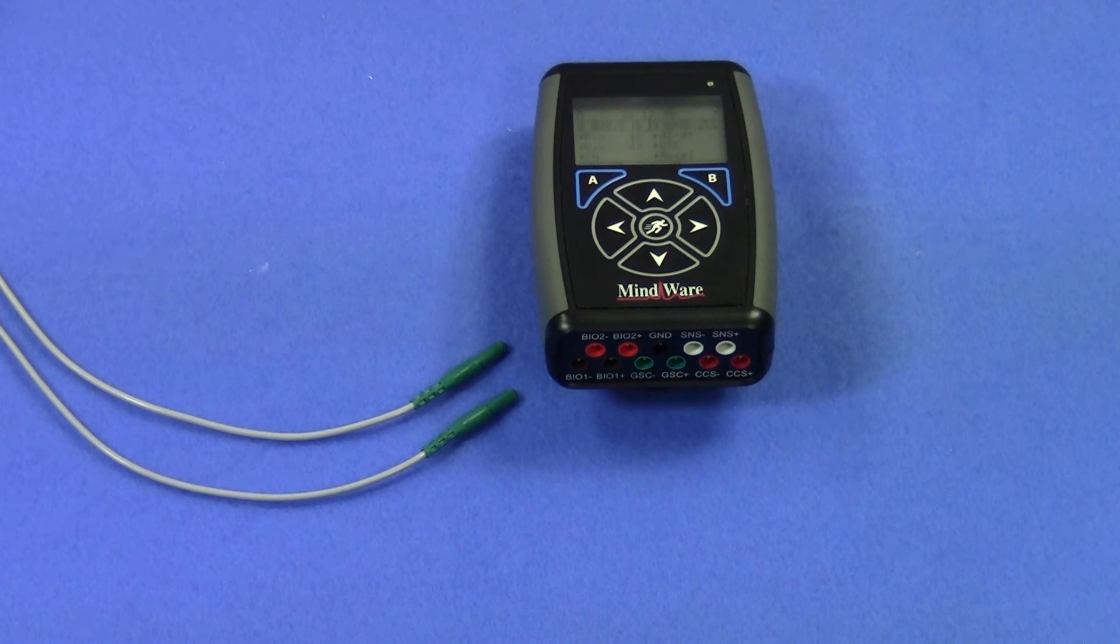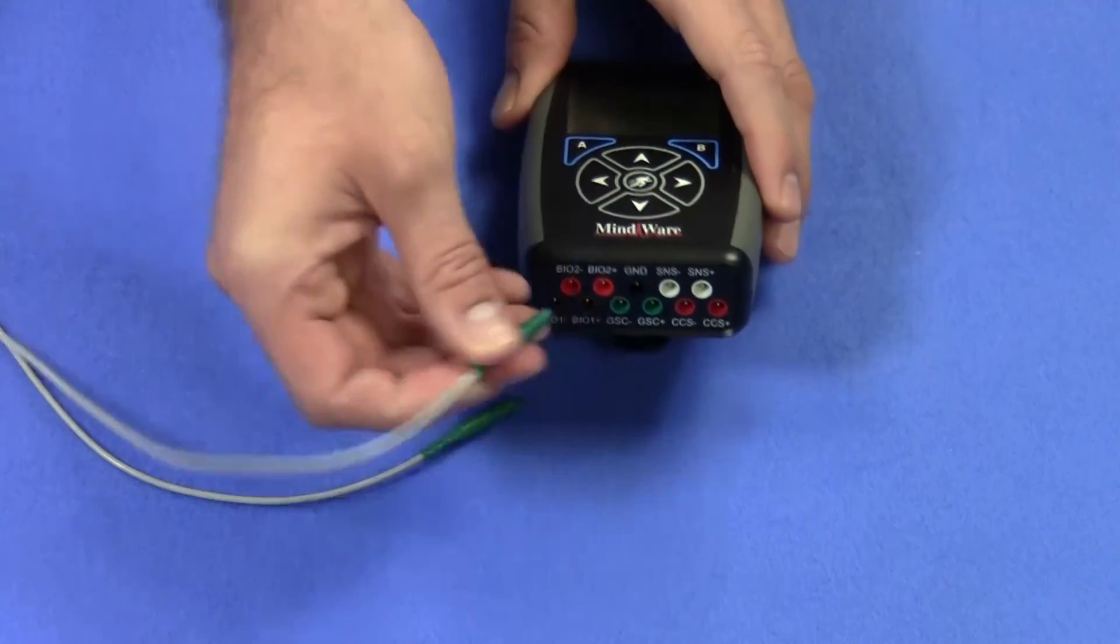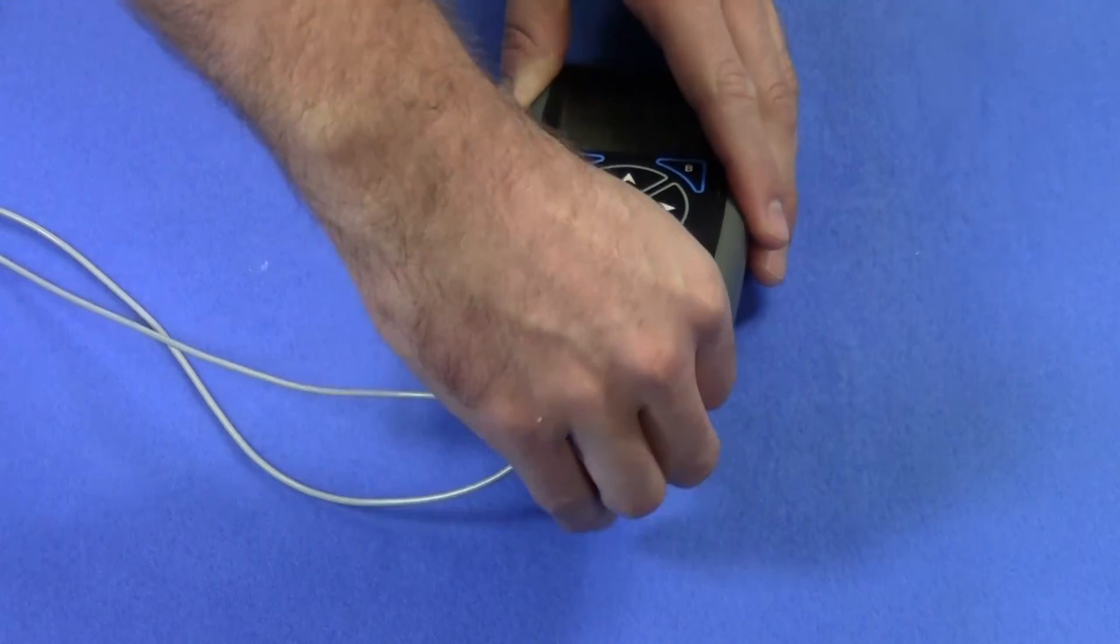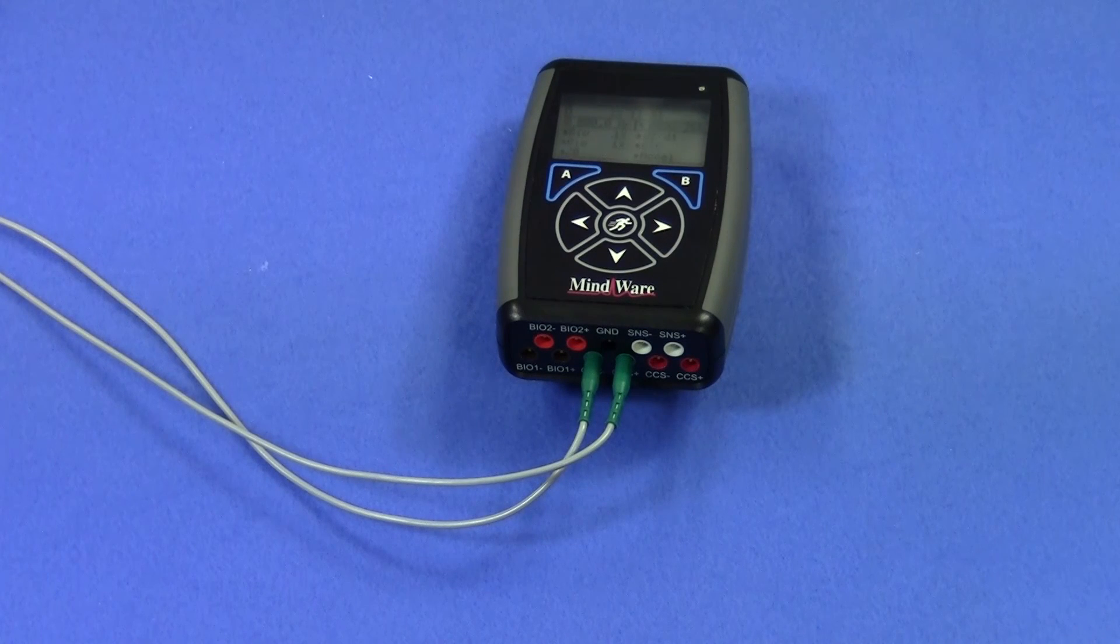Once the electrodes have been placed, the leads can be plugged into the data acquisition device such as the MyWare Mobile. You can see the lead colors correspond with the channel. Unlike some other measures, polarity does not matter with EDA, so either lead can be plugged into positive or negative.